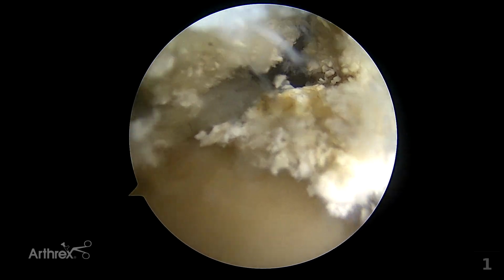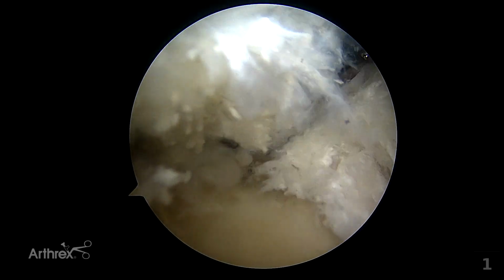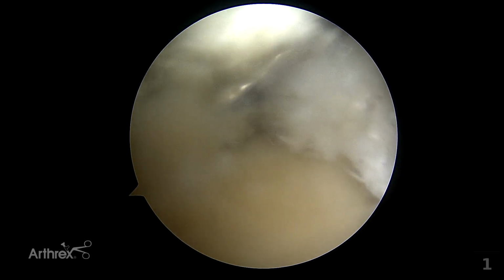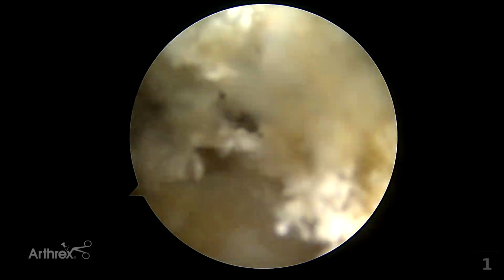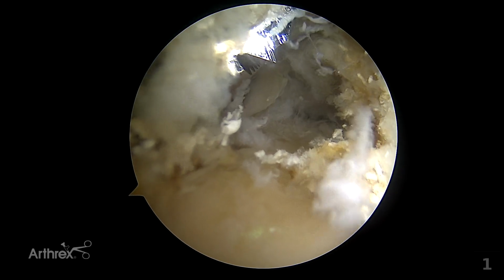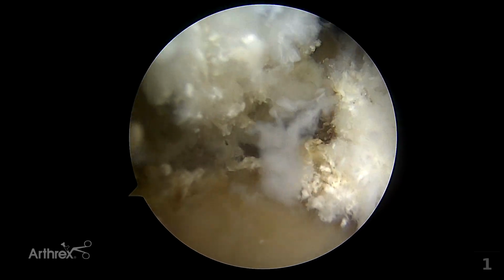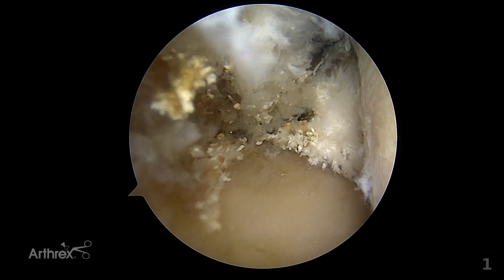But you can also take the PoweRasp oftentimes from the back of the knee through your cannula and come at that osteophyte right directly like this. PCL is to the left. You're in line with the PCL fibers, oddly enough. So we're just knocking off that osteophyte right there and burring it down, getting ready for the root repair. So there we've trimmed that corner osteophyte down with the sharp teeth of our PoweRasp in a controlled setting in a very tight position, but this gives you controlled volumetric extraction of bone without bouncing all over the place. So now we'd get our scorpion in there and do our root repair in a standard fashion.